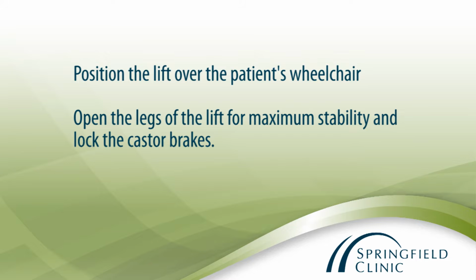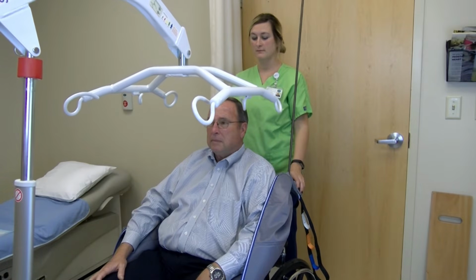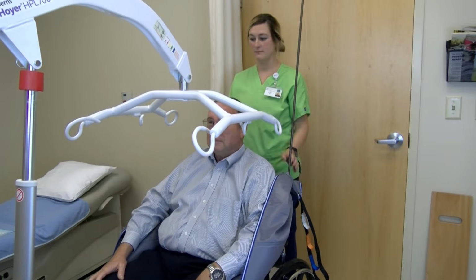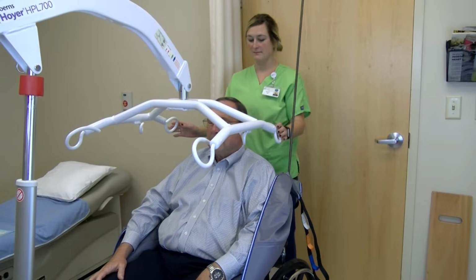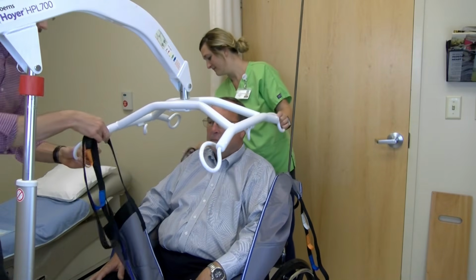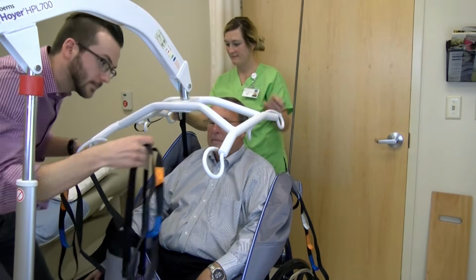Position the lift over the patient's wheelchair. Open the legs for maximum stability and lock the caster brakes. Lower the boom and position it so that the sling bar is parallel to the patient's shoulders. Attach the straps of the sling to the sling bar. Don't forget to crisscross the straps under the patient's legs and make sure that the straps by the patient's legs attach to the front of the sling bar. Use the same color strap for both legs.